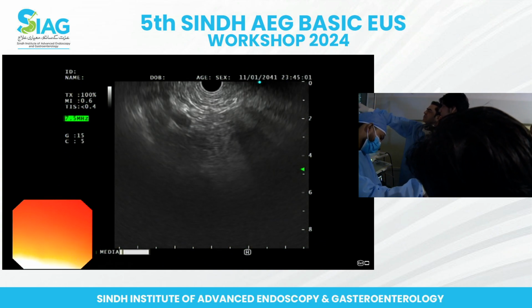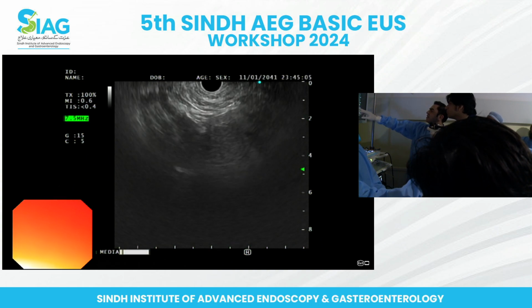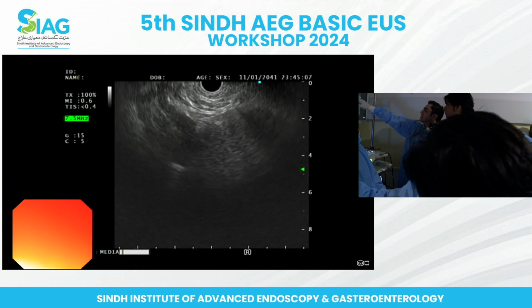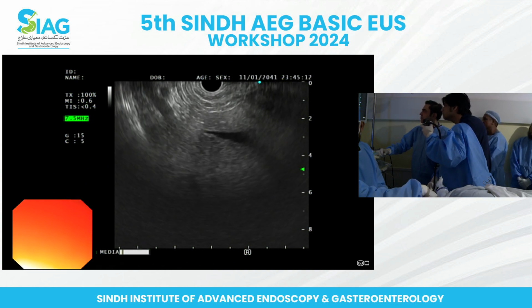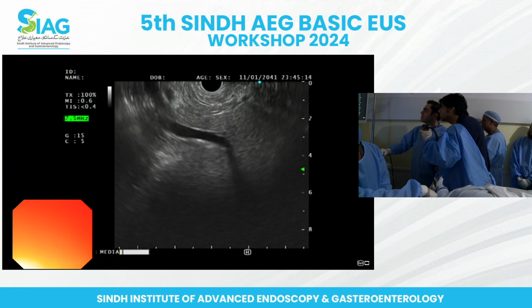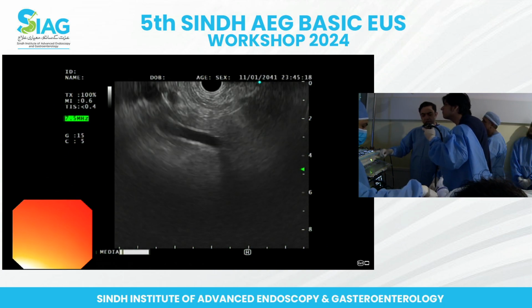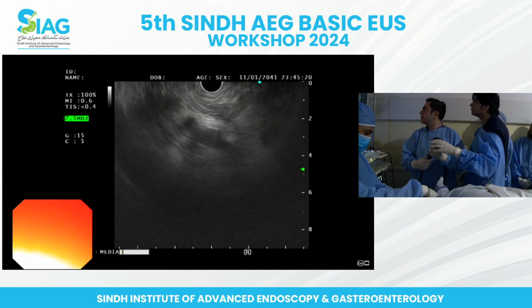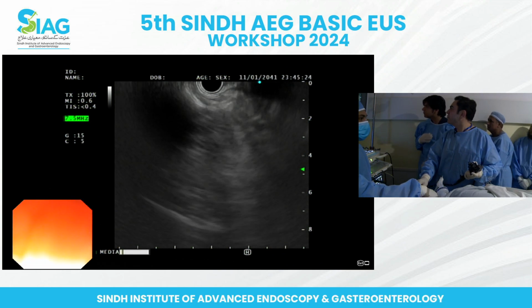So that's going down into the portal vein. The images are not very great, are they? See if you can follow it towards the tail. So clockwise rotation. You seem to be stuck in that hernia again. Just show me. I think it's just at the edge. Let me just see. Where are we?